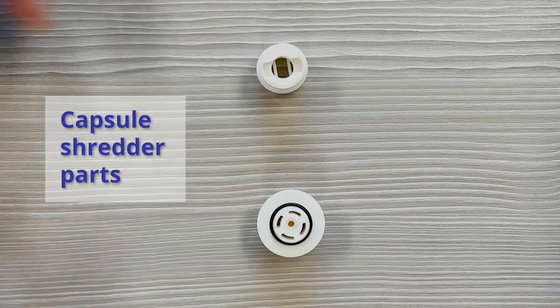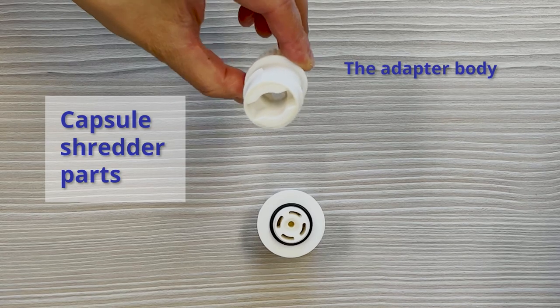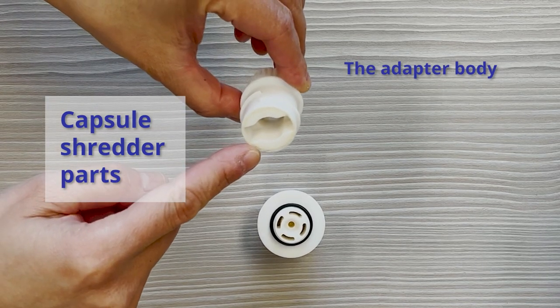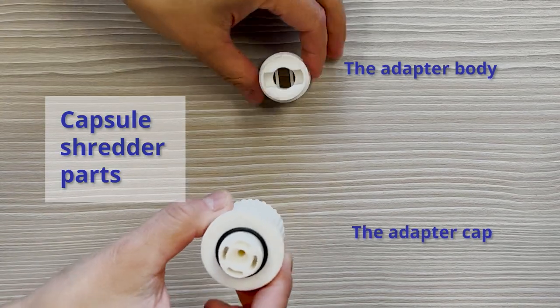Here is how to use it. First, the capsule shredder has two parts. The first part, the adapter body, contains a capsule-shaped hole where the capsule is placed. The second part, the adapter cap, screws onto it to allow the capsule to be shredded.